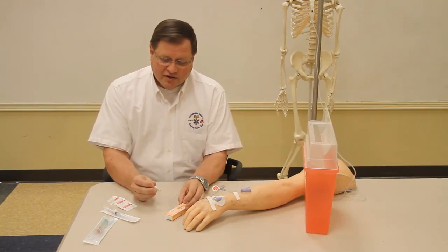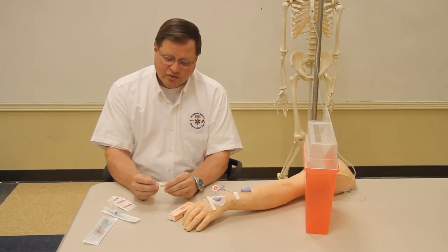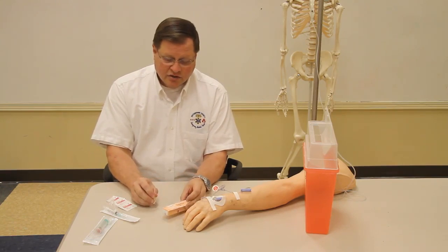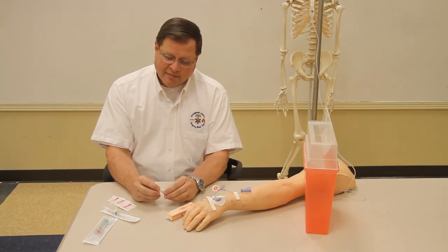The drug comes in several different ways. It comes in a multi-dose vial, and it also comes in a 2 milliliter ampule, such as this one. And it also comes in a Bristojet vial, like this one. And I'll be demonstrating just the ampule and the Bristojet vial.